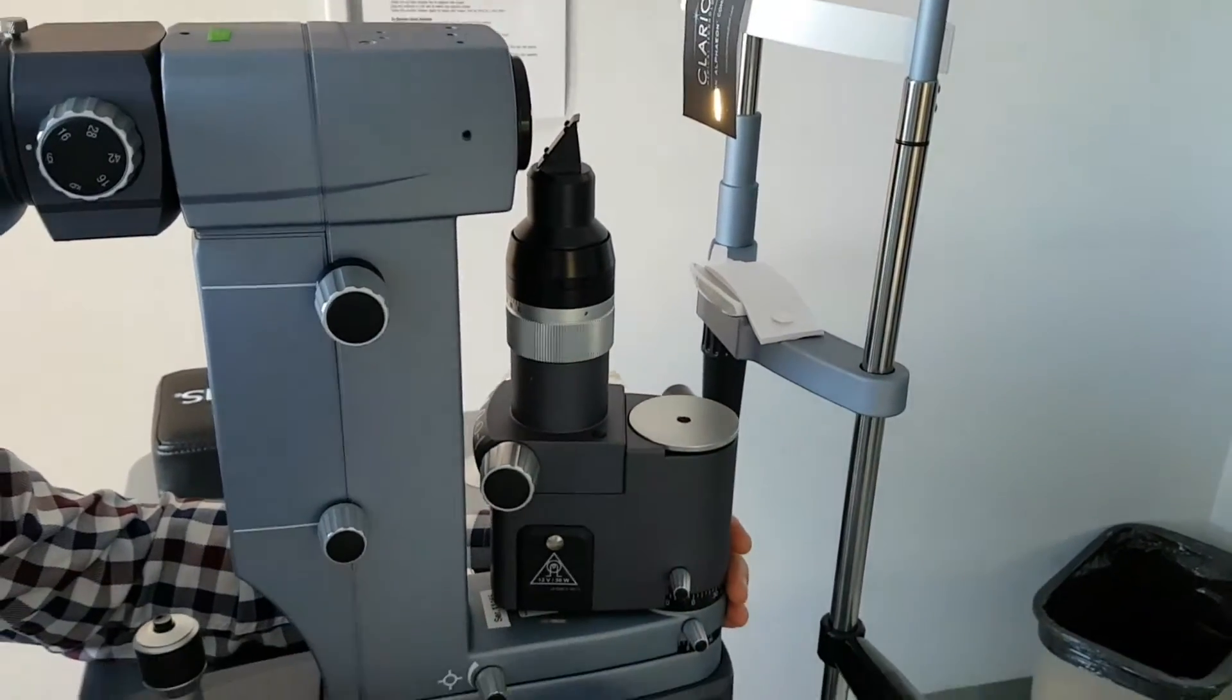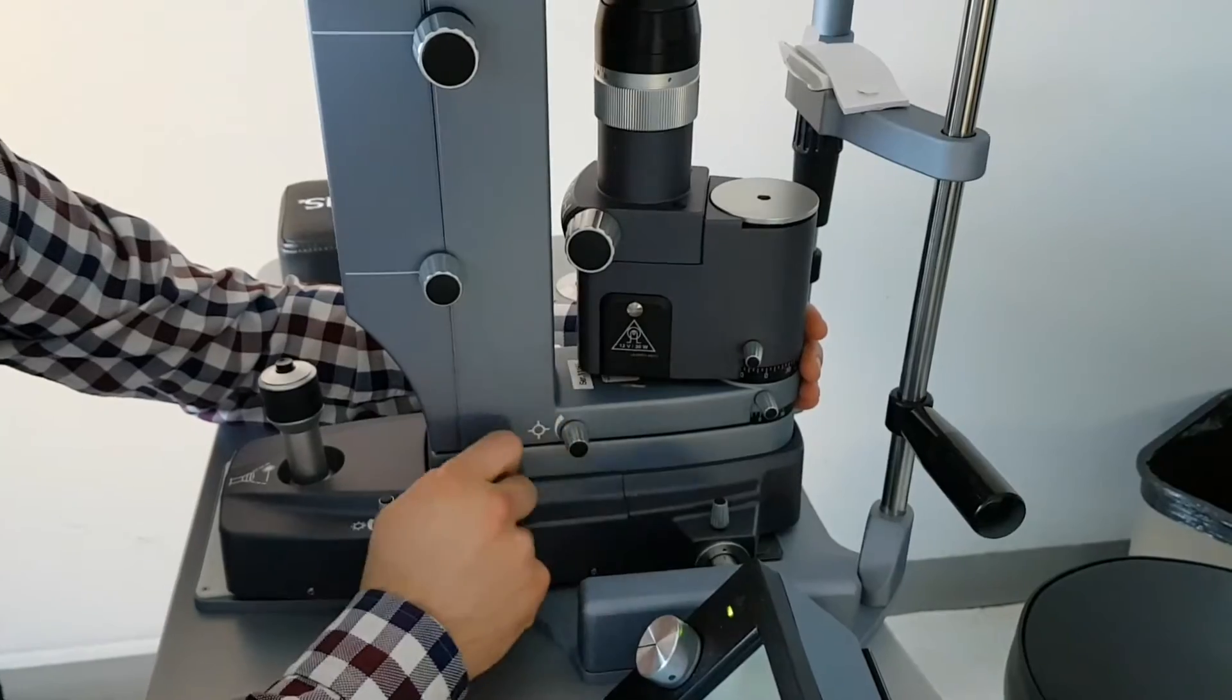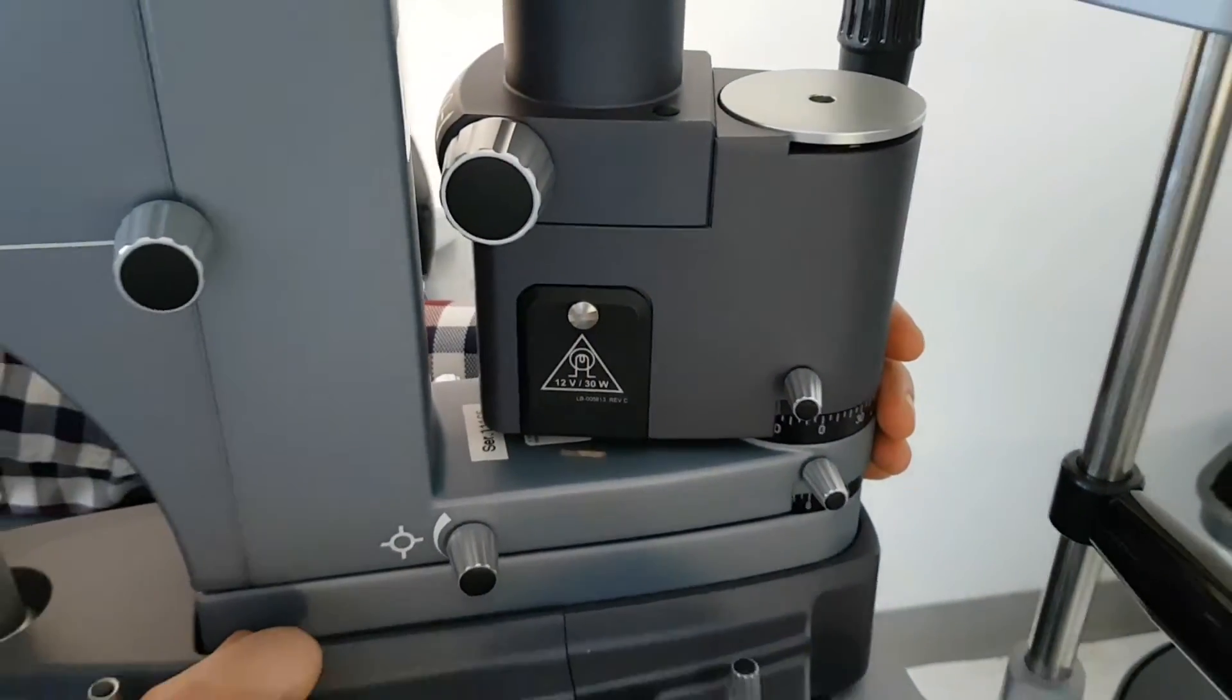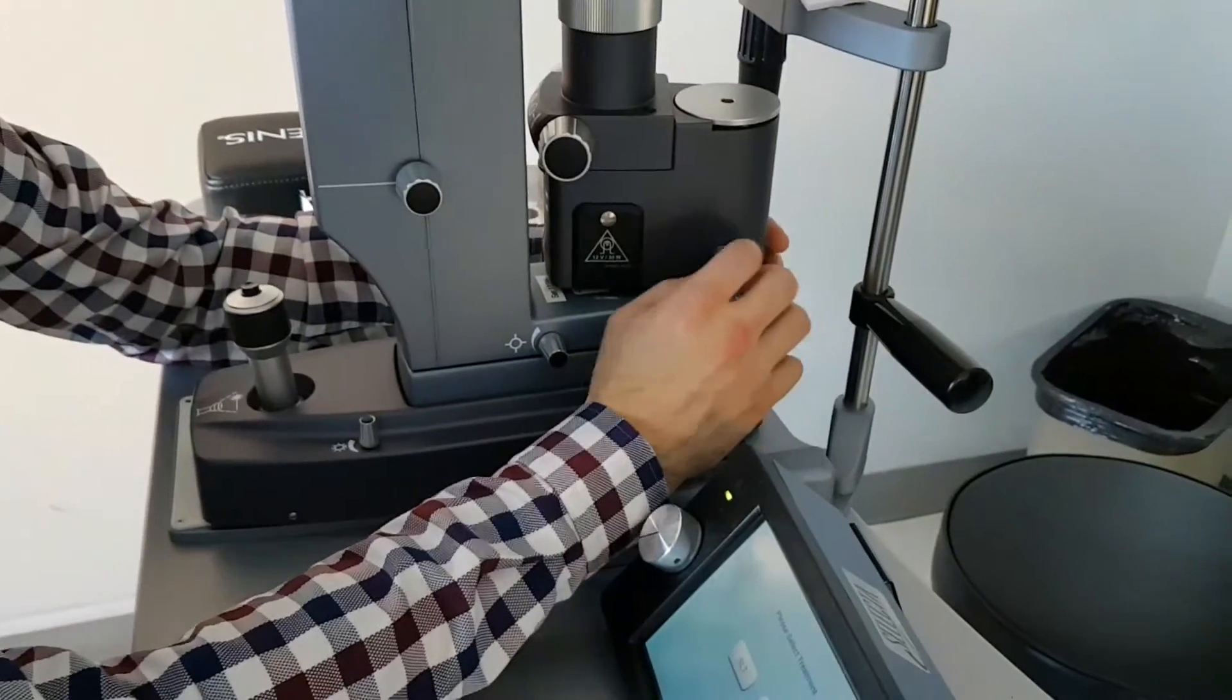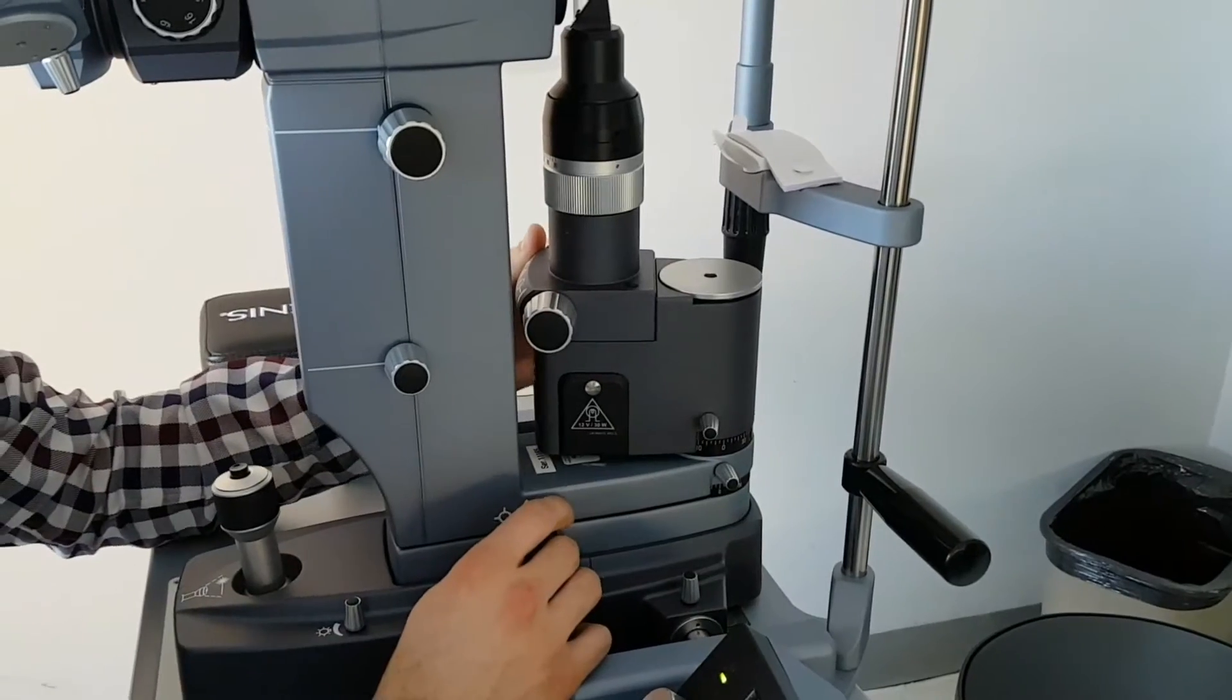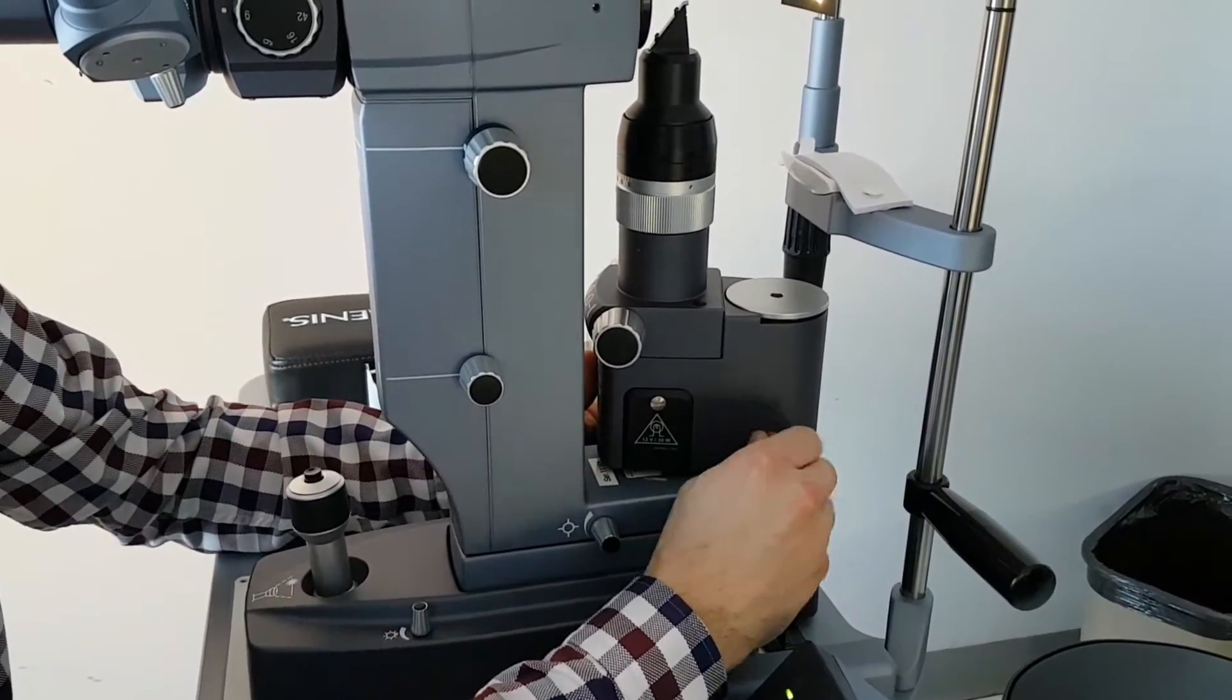If the bulb ever runs out, there's a little opening here. Just unscrew it with a penny or something and replace the bulb. You can lock the rotation of the slit lamp with the little knobs here.